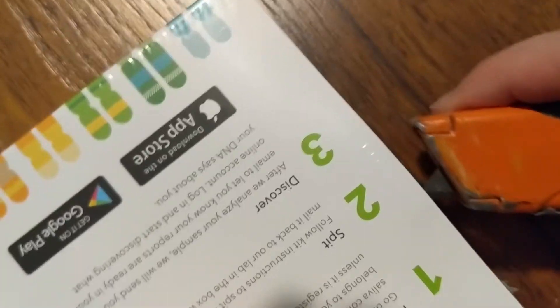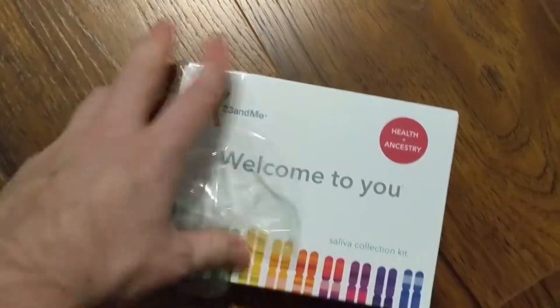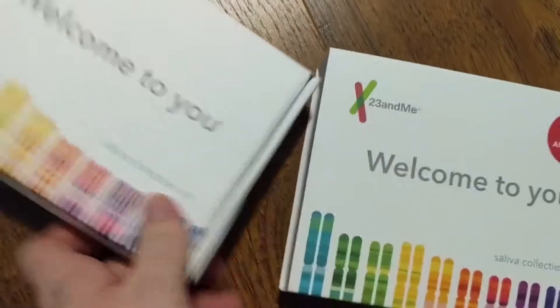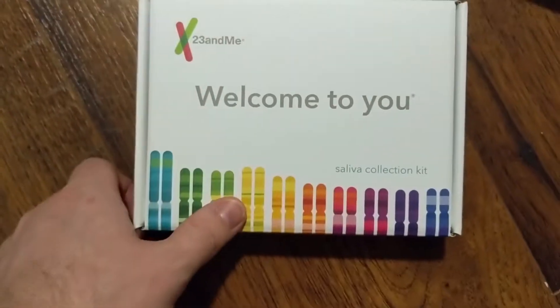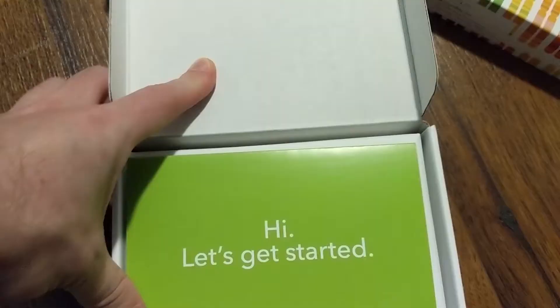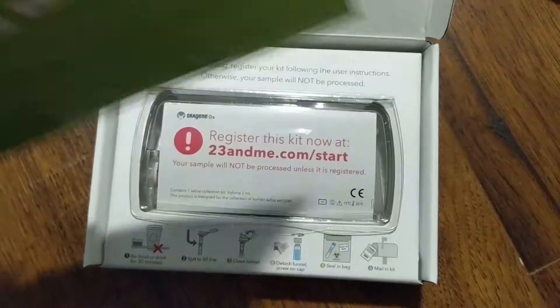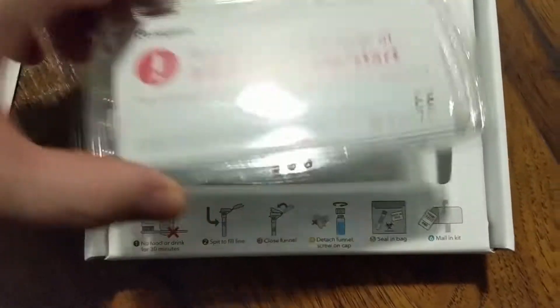All right, let's open it up. Now you just got to slide the box out. Let's open up the kit. All right, it has a menu — it has instructions on how to get started. Got to register before we mail everything.